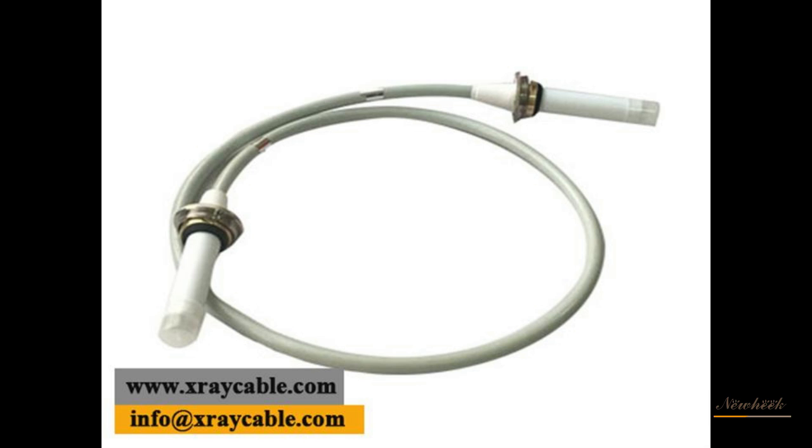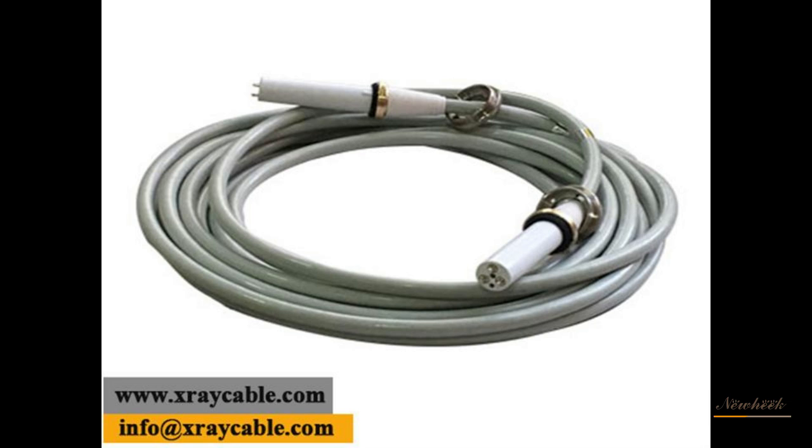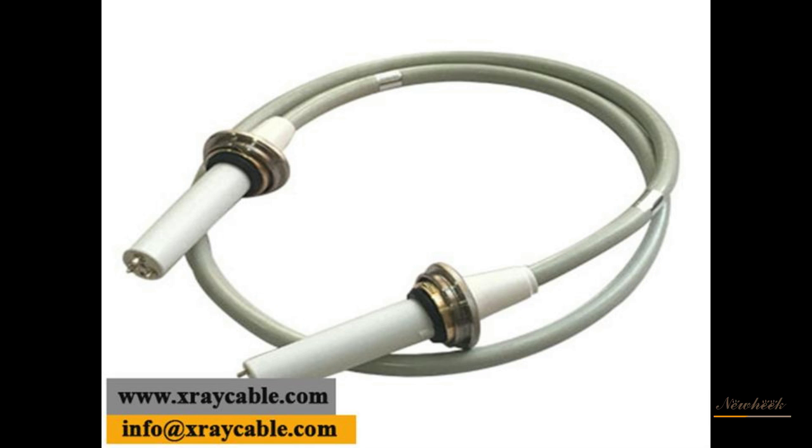There are three aspects of X-ray application in medicine: X-ray diagnosis, X-ray treatment, and X-ray protection. The high-voltage components of an X-ray machine consist of the ball tube, high-voltage generator, and high-voltage cable.